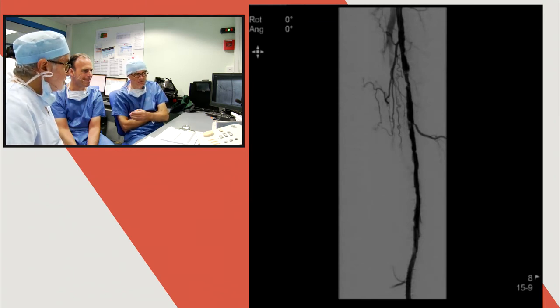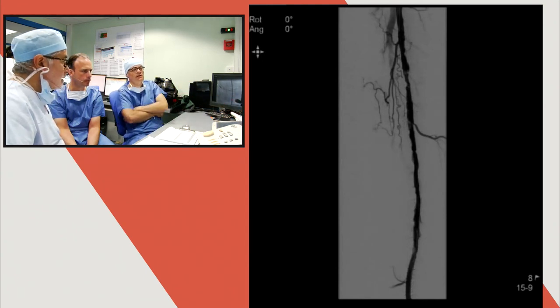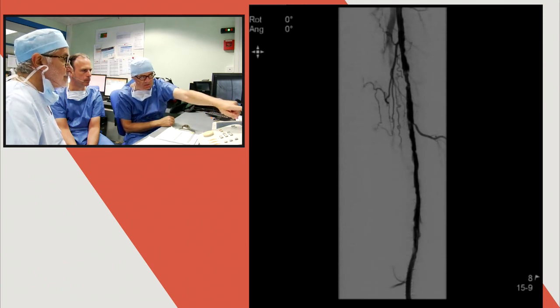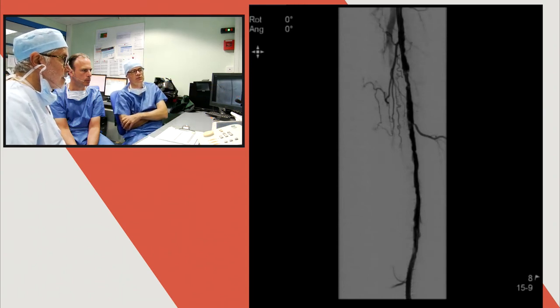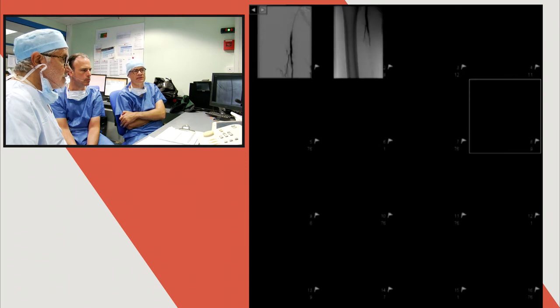The more severely calcified area is proximal to the short stent, so we have bilateral calcium, and the decision was made to include the old stent into the stent area where we can implant one single 15 centimeter long Eluvia drug-eluting stent. And then we will, in addition, perform a drug-eluting balloon angioplasty.